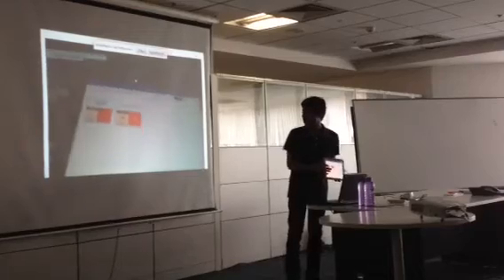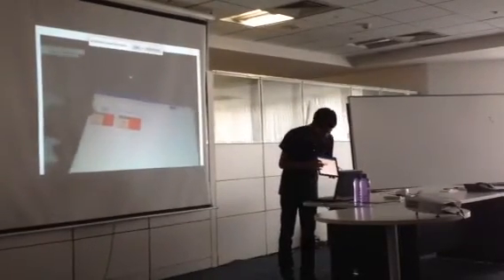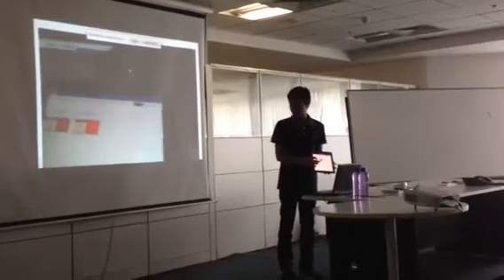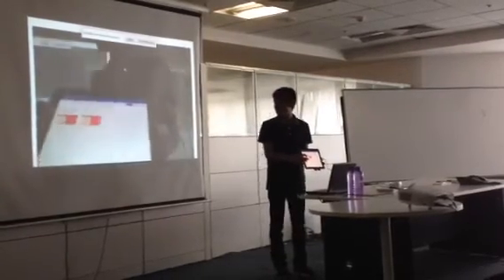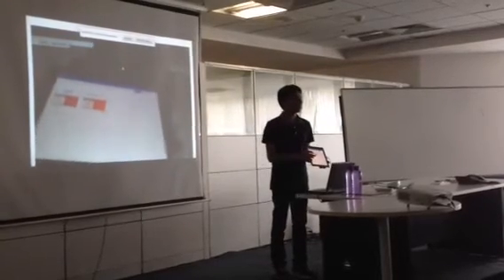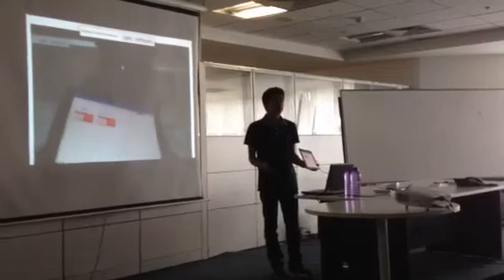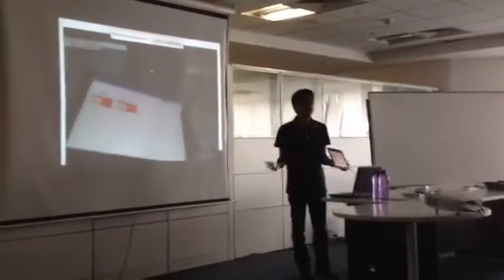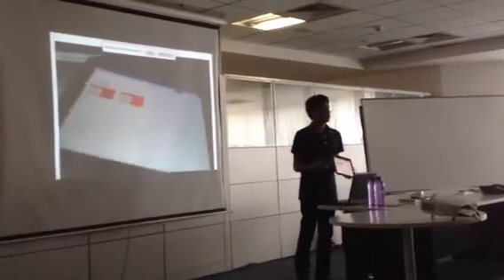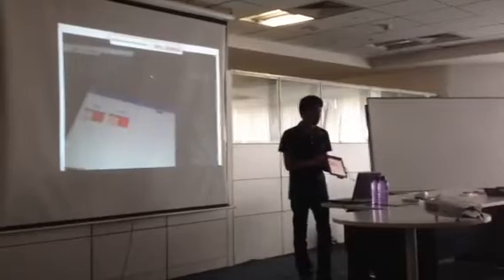These bottom two cards represent statistics about the patient. The first card represents the age and the gender. The second card represents the highest pathogenicity level of the patient. So basically, if a patient has several variations that are dangerous or benign, etc., you would see the highest or most dangerous on the screen itself. So the doctor can view the report right away.